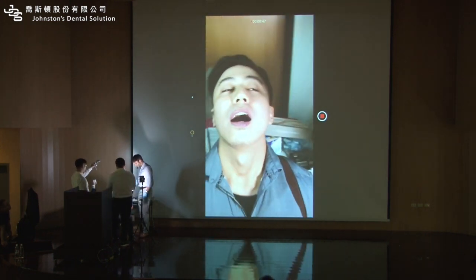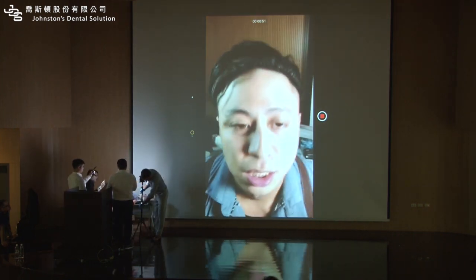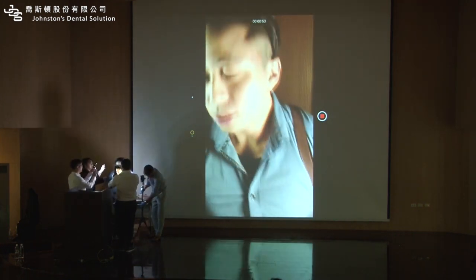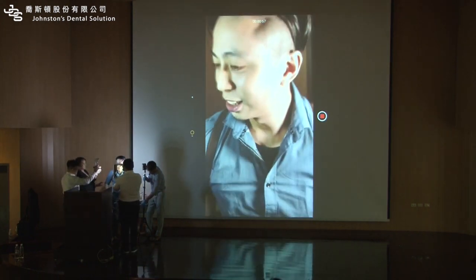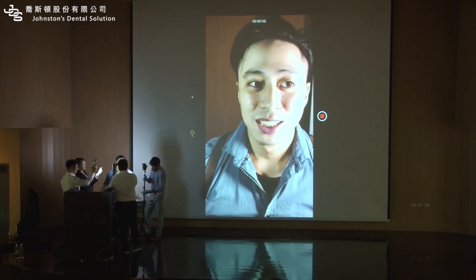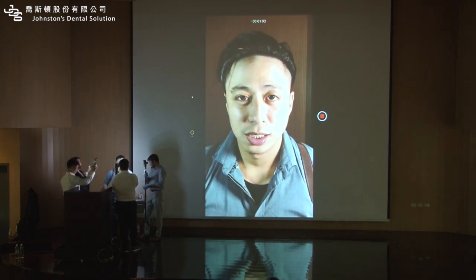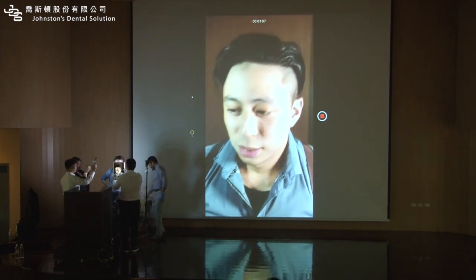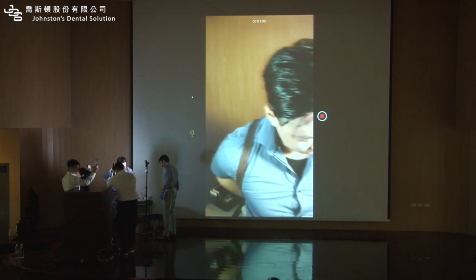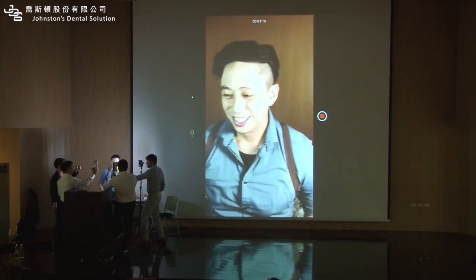Bring forward your head. Stand up a little bit. And now, usually when I have the after pictures, I usually like to make them standing up. Because when the patient is standing up, he can actually relax a little bit and be more casual and give me some better, cooler images. You can have the light here.